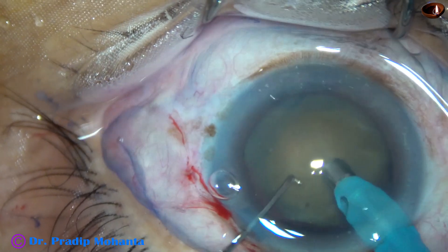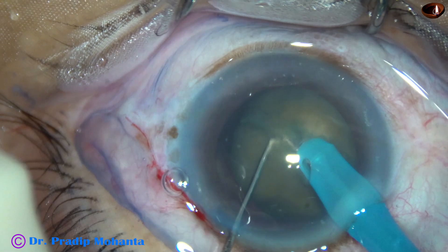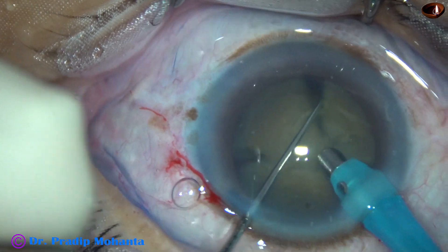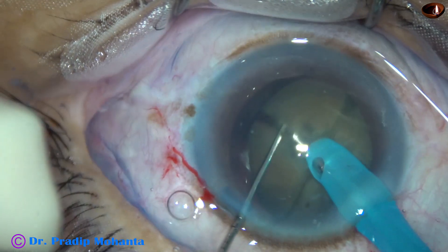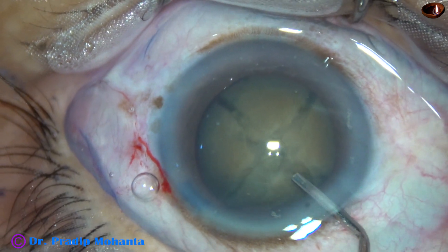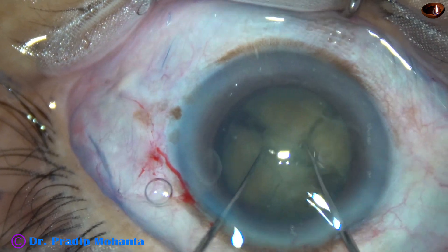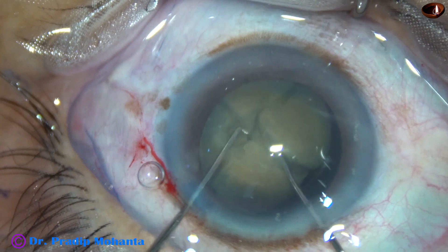And now this is going to be difficult. This kind of cataract is very much leathery — it has a leathery posterior plate. We can make some cracks, but it is not possible to make free fragments by chop, as all the fragments get attached to each other at the central posterior plate. So my plan is now to manually separate the pieces. I am going to use two hooks and try to separate the pieces, but there is a stubborn band posteriorly which is not allowing the pieces to be free.